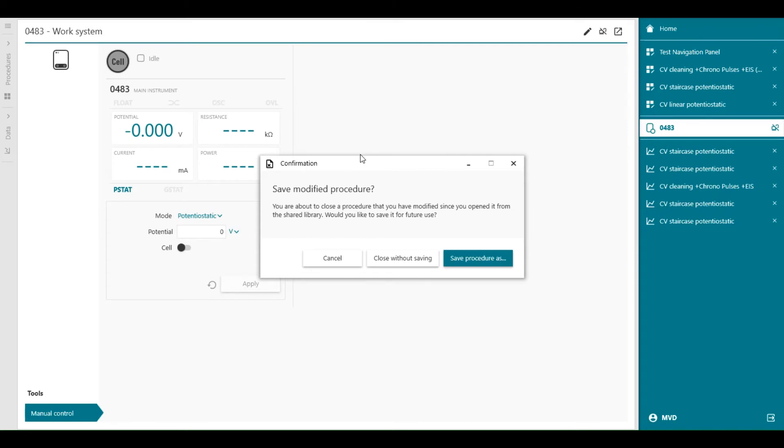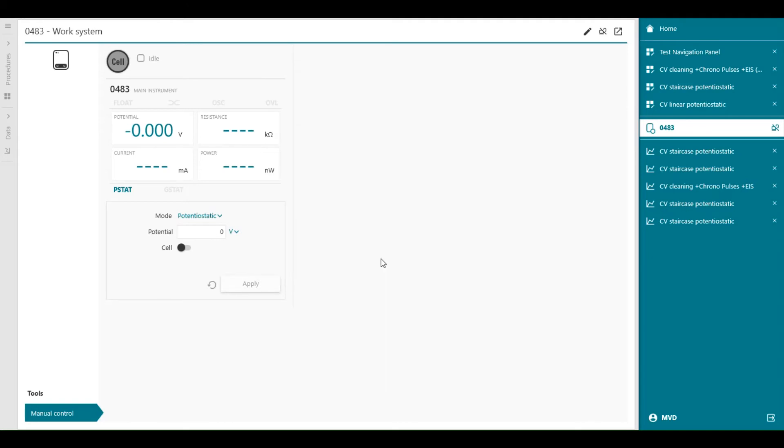If we try to close the procedure which we have not saved, we will be prompted to save it. So this window appears, save, modify procedure. You can say close without saving if it's a procedure you don't want to use anymore, so you can close it.